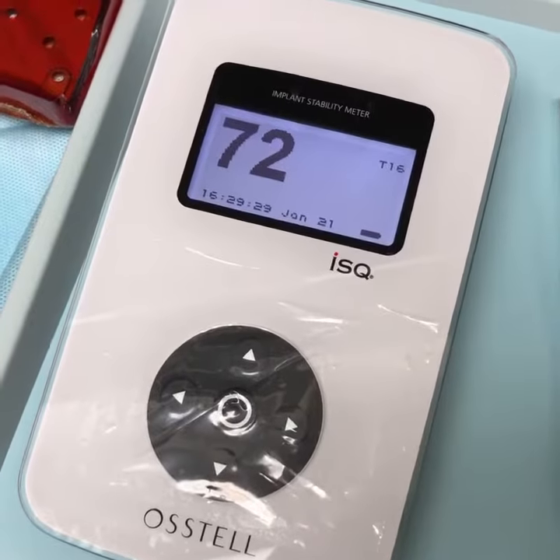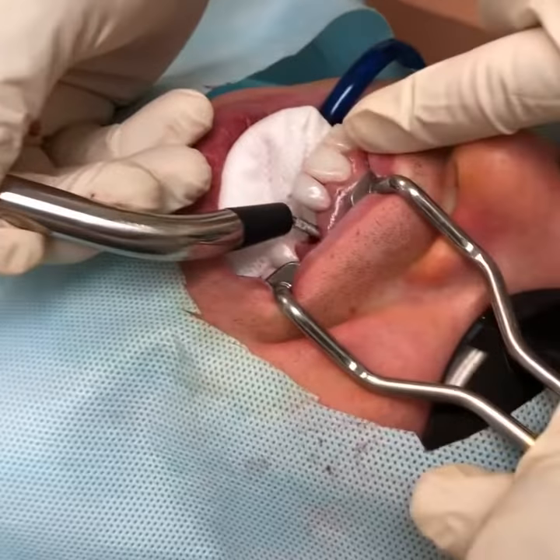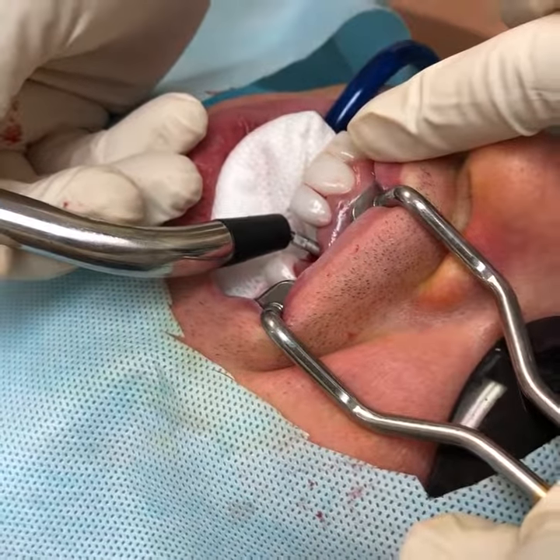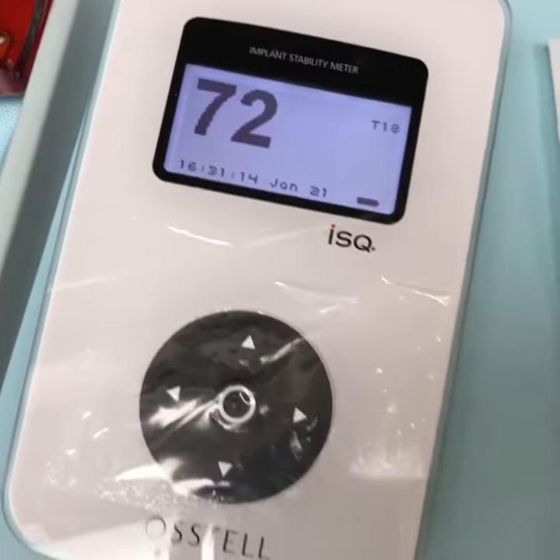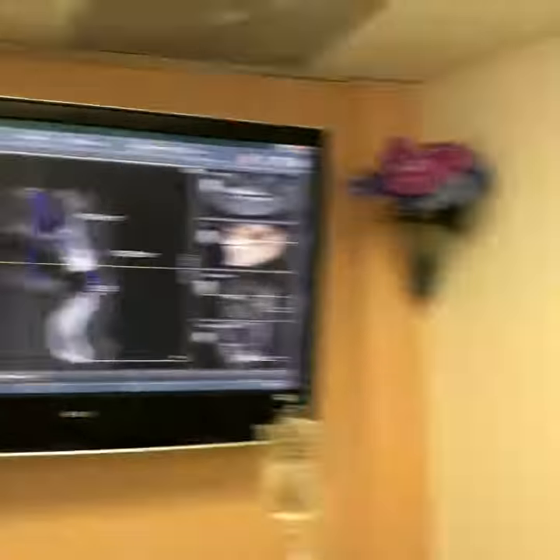This is the unit we have, and there's a probe that I'm going to bring close to the implant. It's going to show us a number. The implant has been placed based on the cone beam CT scan, which shows us exactly where to place the implant to make sure we get the best result.